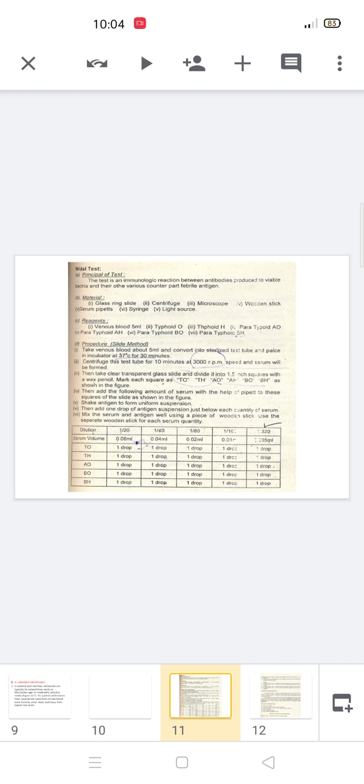In a test tube, this is a yellow color medium, TSI. Must remember, this agar is not used for the growth of microorganism, it is only used for the biochemical analysis, which type of enzyme, which type of metabolic activity is performed by this microorganism.